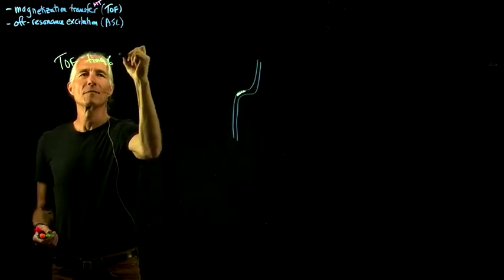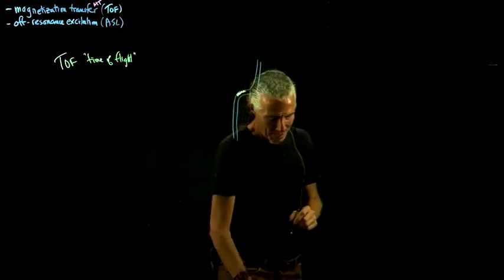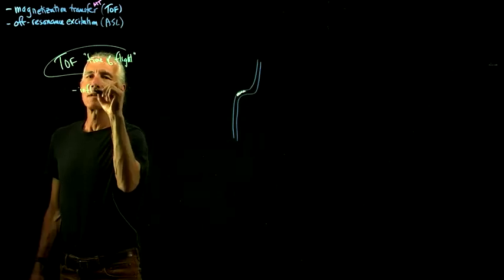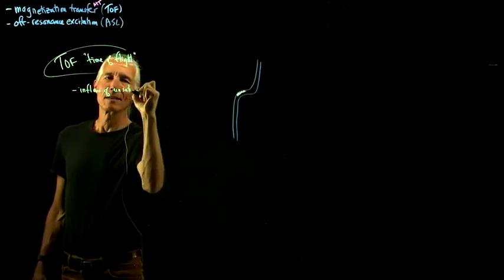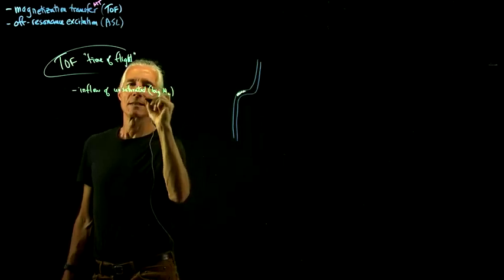Time of flight is what it means. It just doesn't really make sense, time of flight. But basically, what is it? It's just the inflow of unsaturated spins, which means big longitudinal magnetization spins.